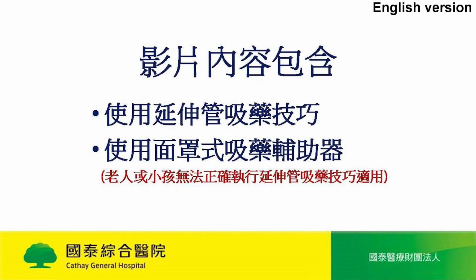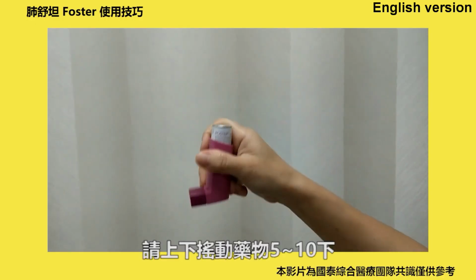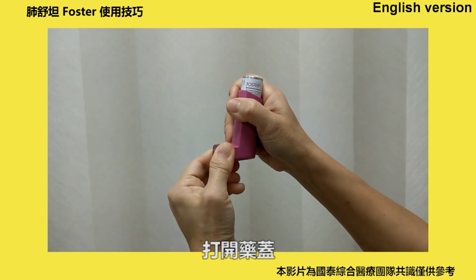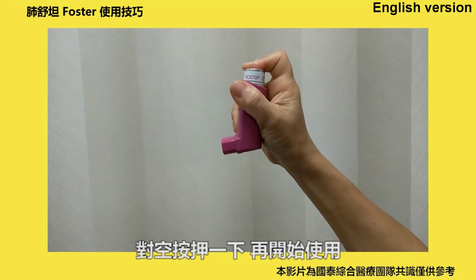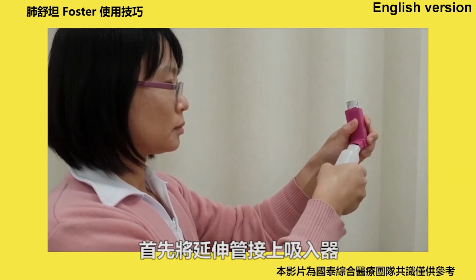Please follow the instructions. Before using for the first time, shake the inhaler 5 to 10 times. Remove the mouthpiece cover. Before using the inhaler for the first time, you should test your inhaler to make sure that it is working properly. Prime with one test spray into the air and away from your face to make sure that it works. Connect the extension tube with the inhaler.